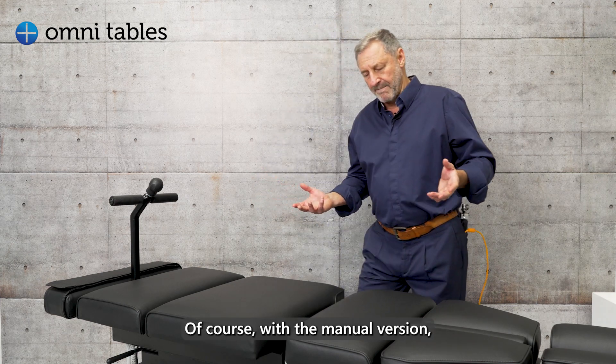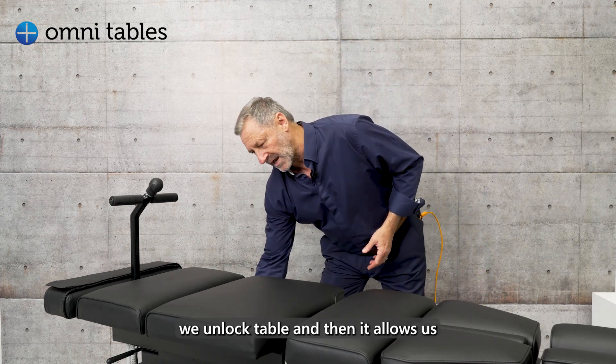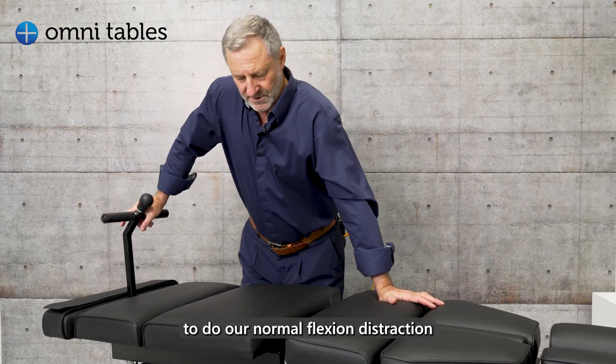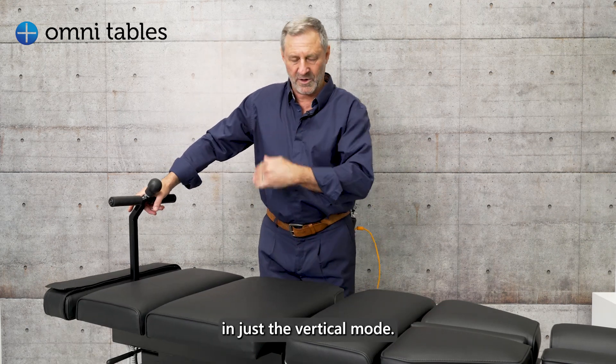With the manual version, we unlock the table and it allows us to do our normal Flexion and Distraction in just the vertical mode.